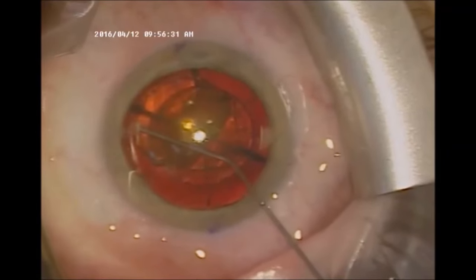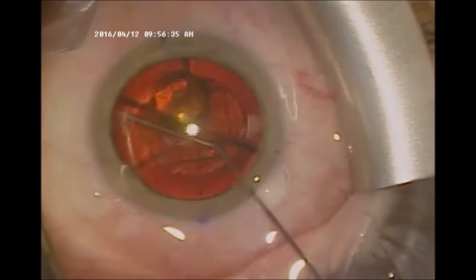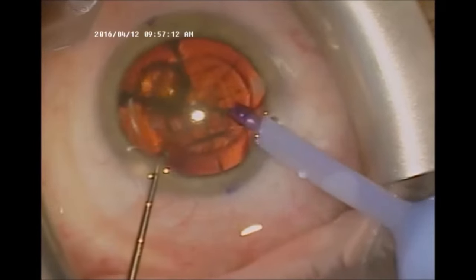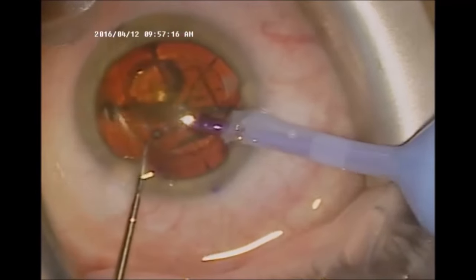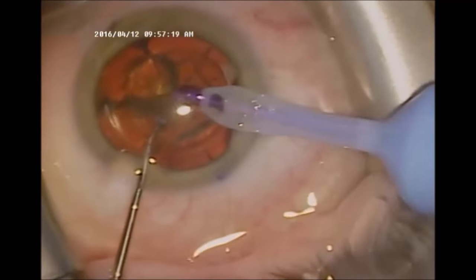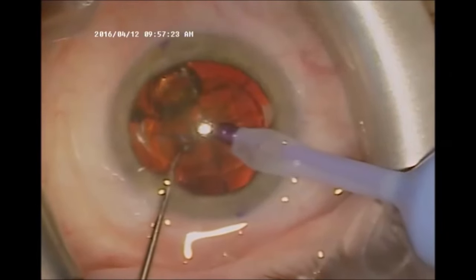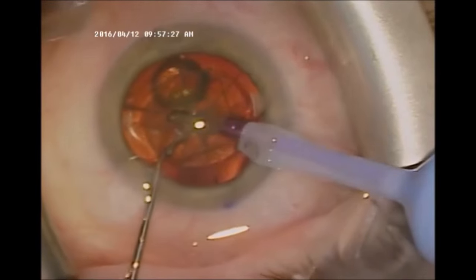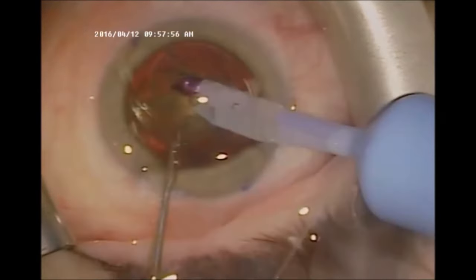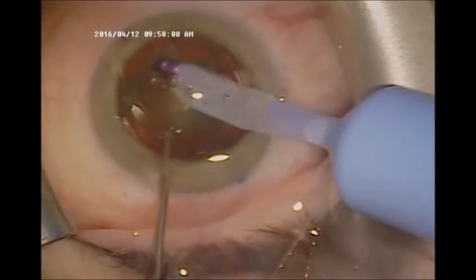Here I use BSS, or a type of saline solution, in order to free the lens from the capsule. I use ultrasound energy or phacoemulsification in order to finish the fragmentation of the lens. I make one pass here. Most of it has already been done by the laser. And then I start to break the lens into smaller, more manageable pieces.